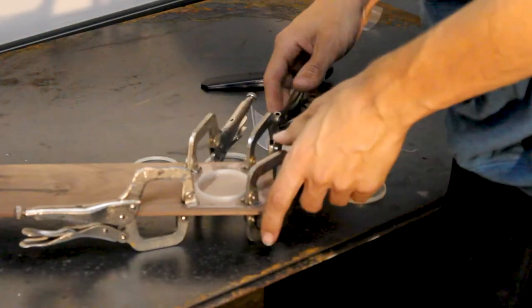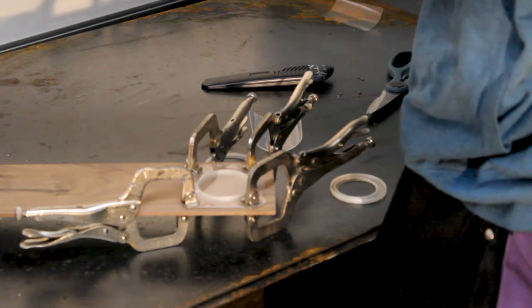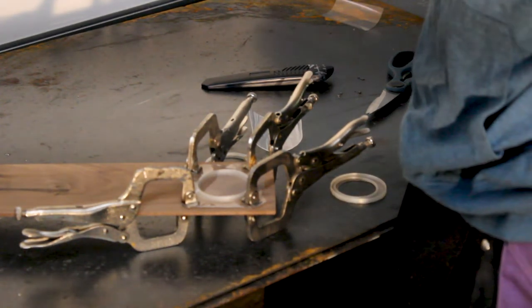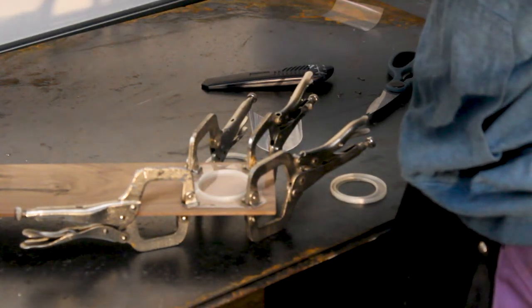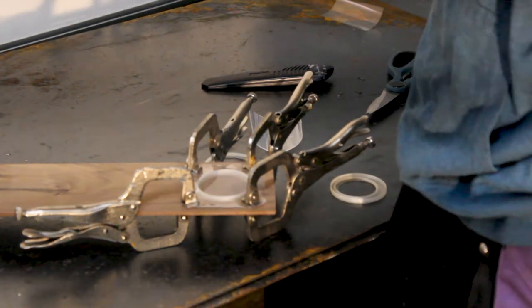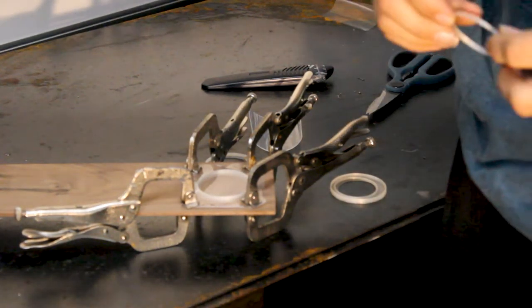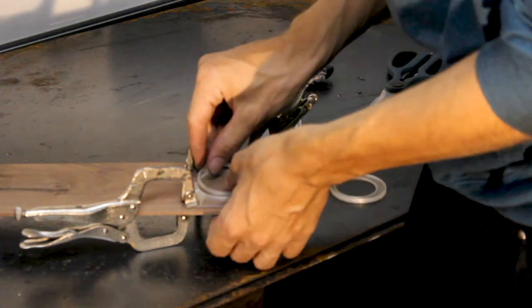Sweet. Okay. So yeah, like I said, this is a dry press. My edge here is pretty good. If it was frayed or inconsistent, or if I printed it the other way to where there was a sharp edge off the print bed, then I would have to sand that down with some pretty fine grit sandpaper. But this is pretty good, so I'm gonna press it.